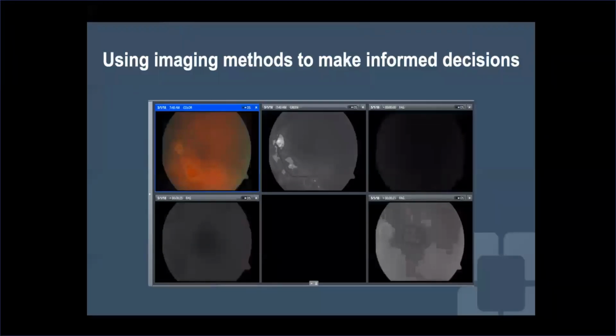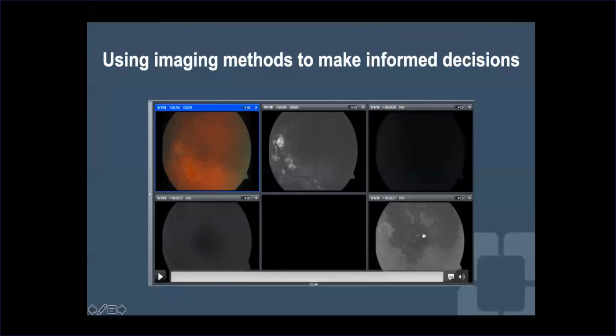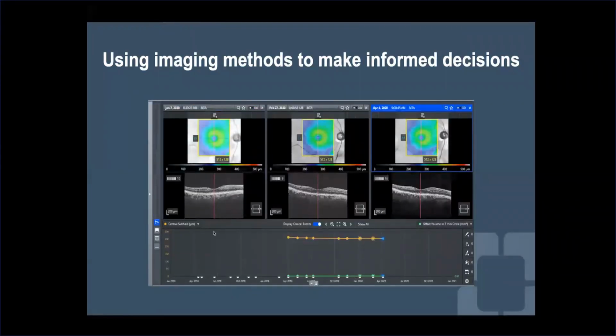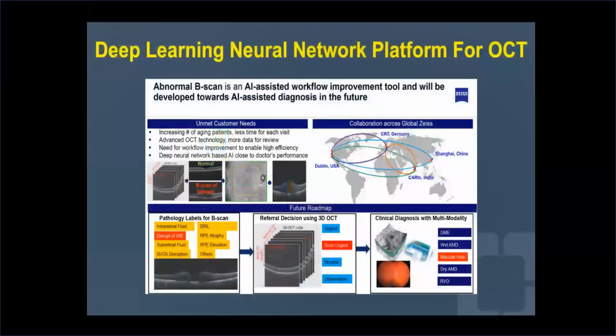It's able to pick up the actual timings on the fluorescein and automatically puts them in front of you in the way you'd expect it to look. Here you can see that that's obviously a fluorescein positive leakage point here, and that was when we had that patient who had that component, and we noticed that conversion. So that's why we initiated therapy in that patient through this analysis.